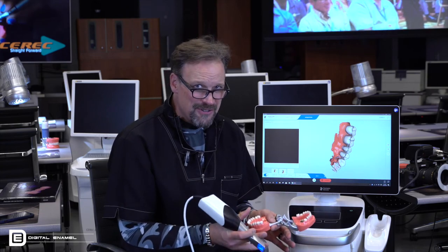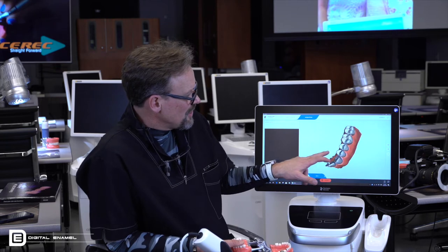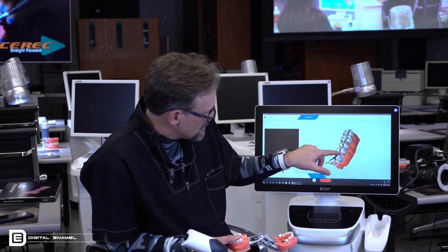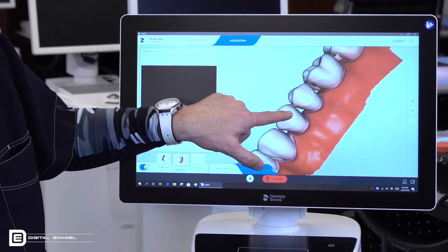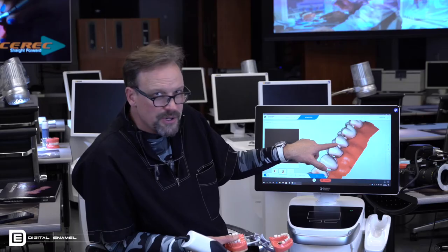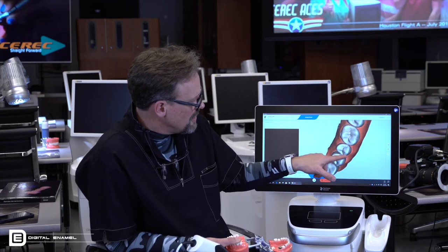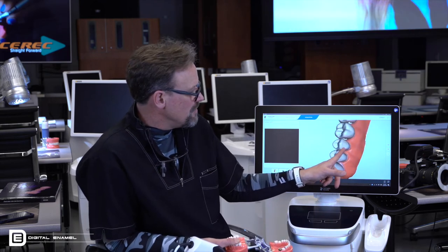Stop and evaluate. I've said this countless times to students in our class, just so you can look around and see what's happening. Now I know on this dentiform there are some holes in here which aren't really real, because human gingiva usually comes up farther. But this information that's missing on the mesial surfaces of these premolars literally does not matter, not even one little bit, because I'm going to mill to this surface up here. The rest of this could have holes in it. Heck, there could be a cheek in here or something like that. It doesn't matter. It's what you're going to mill to.